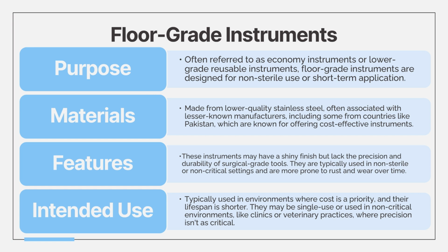But these instruments have to be OR grade and cannot be floor grade instruments, right? And then there's floor grade instruments too, which are used by L&D, emergency department, radiology, dialysis, all of these. So my point is, when you're building trays, there are assignments for building trays for OR cases and also for what we call floor trays. And floor trays just refers to departments that are less critical in their sterility, right?